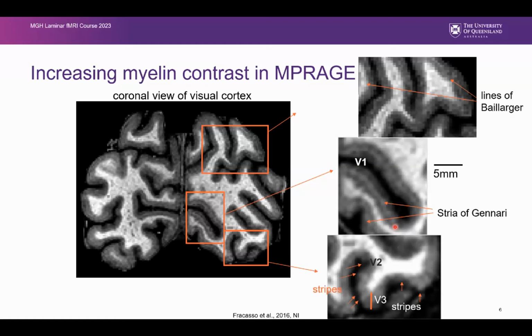Probably not. This is probably not giving you a lot more information than what you would get by getting your gray matter, white matter border, your gray matter CSF border, and just putting in the layers based on your anatomical knowledge. I think this might be interesting if you're working in a clinical population where you expect that for some reason their layer structure looks different than usual.